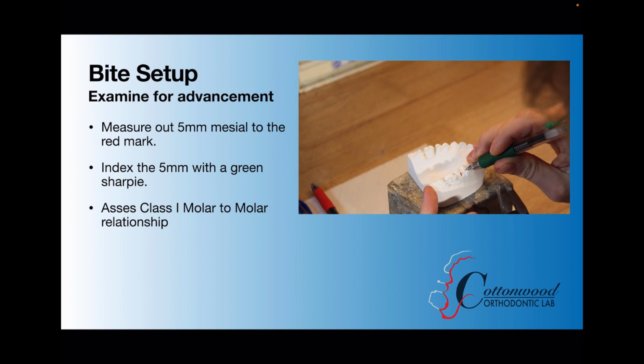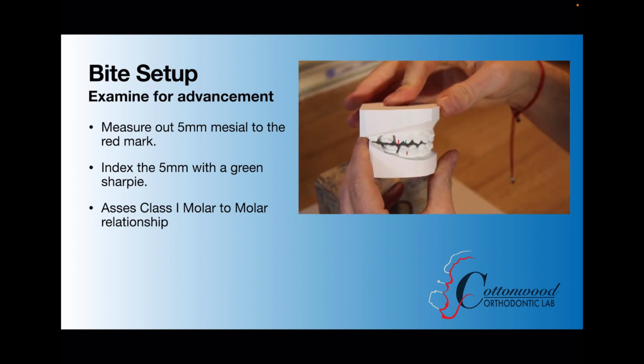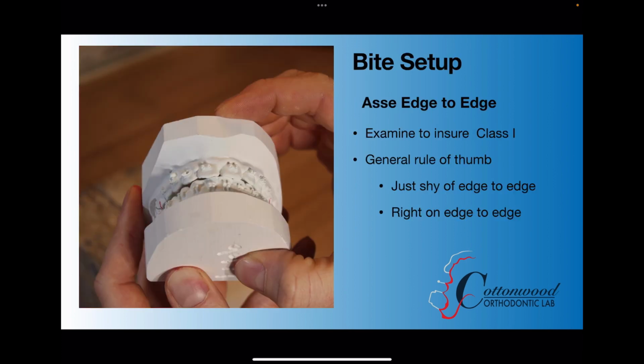After you've done that, you're going to put the two models together. You're going to use the lower red marks and align those with the upper green marks. So this takes us into the class 1 molar to molar relationship. So this is where you're going to start assessing how you're going to build your appliance and where you're going to go with that. With that being said, you need to examine your class 1 relationship and see what else is going on.